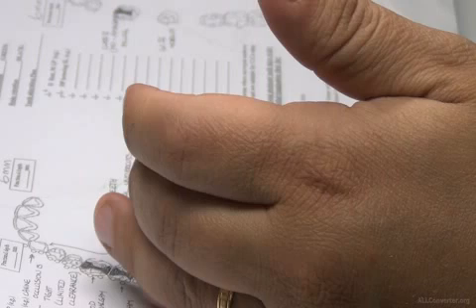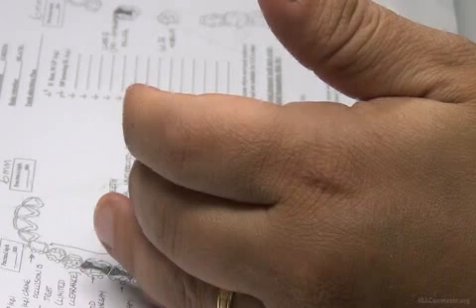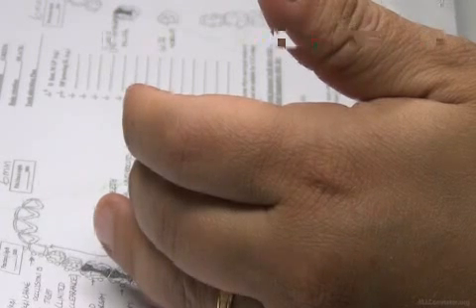Tooth tissue: for tooth-tissue support, I go for stress-releasing designs for the clasping. Stress-releasing design, basically I go to the RPI system. Look at the conditions around. Let's start on this side, the left side.